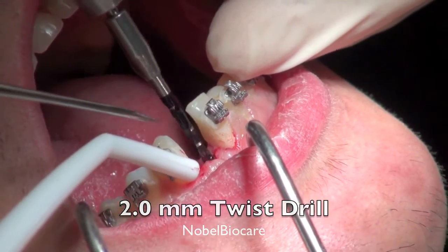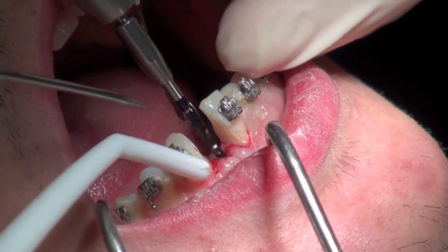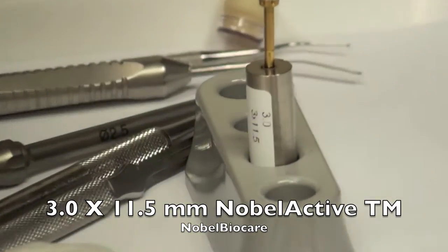Here we are going with the 2 millimeter twist drill, and this is actually the final drill in the sequence. If it was dense bone, you could actually go one more drill, but that was fine.